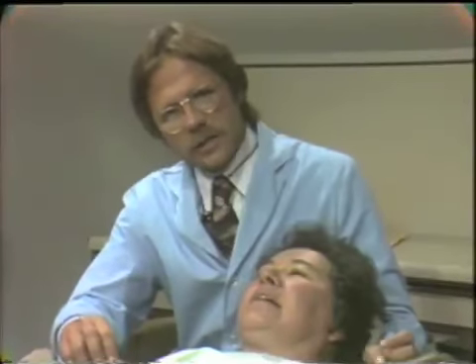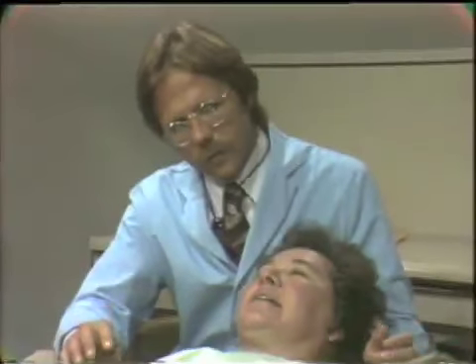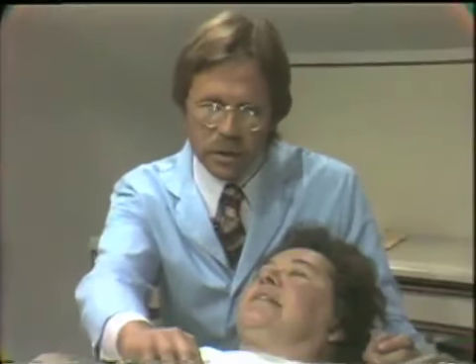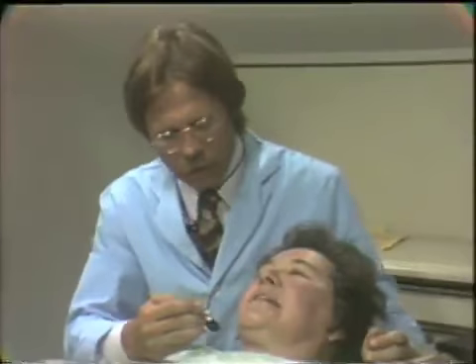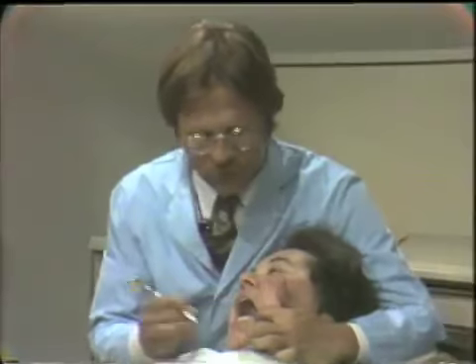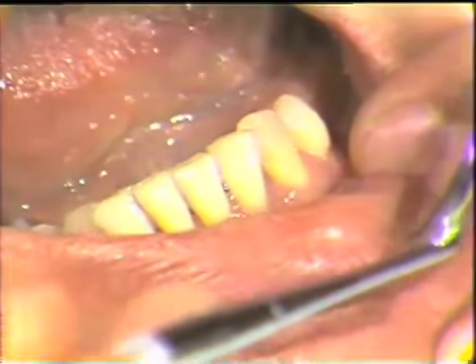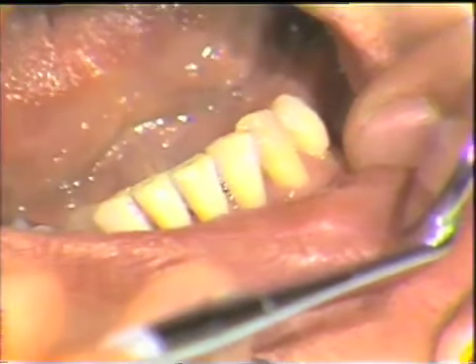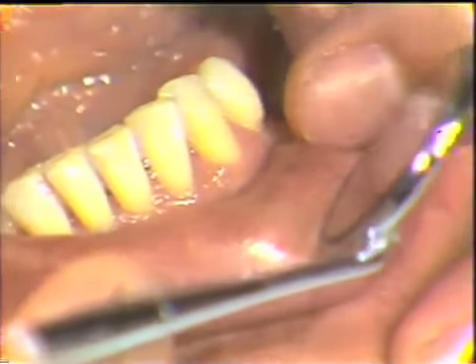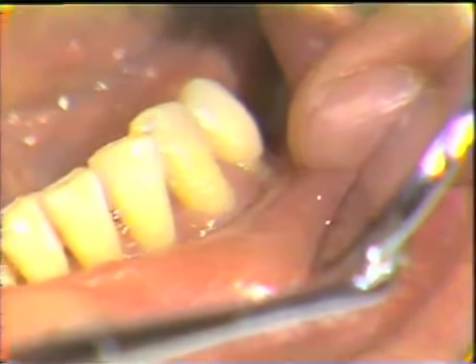The aesthetic considerations are also important to talk over with the patient. Now, we said that the clasp units that lie on the abutment teeth have to be placed on a suitable surface. Now, the suitable surface for clasp retention, namely the labial surface of the tooth, if we're going to use that for our retention, would have to be either enamel, gold, or porcelain.